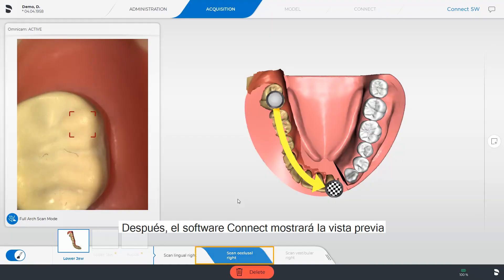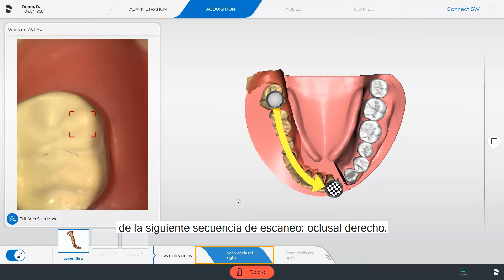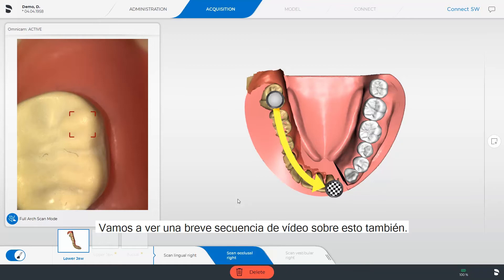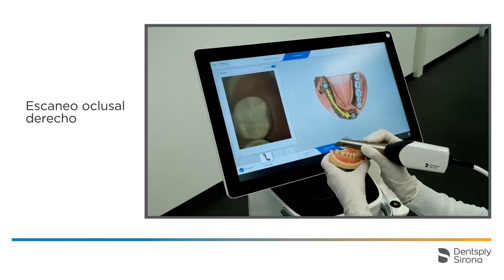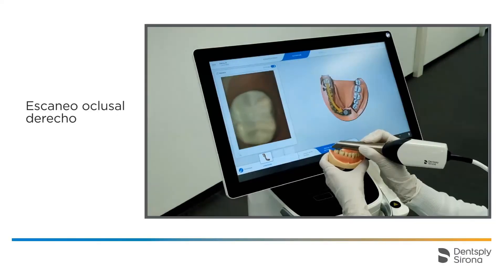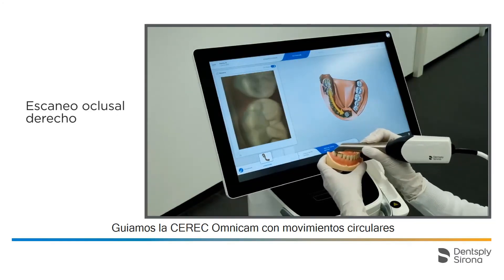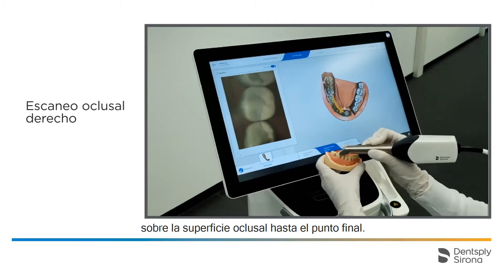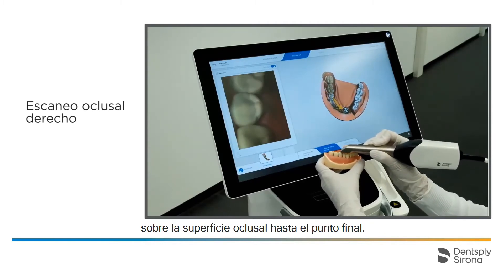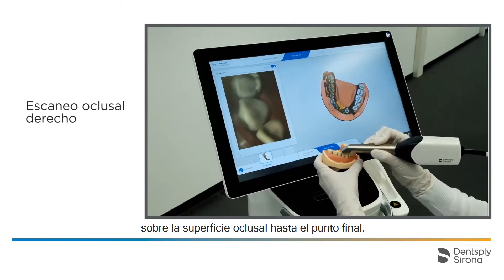After that, the Connect software displays the preview of the next scan sequence: Occlusal Right. We guide the CEREC Omnicam with wave-like motions over the occlusal surface up to the end point.